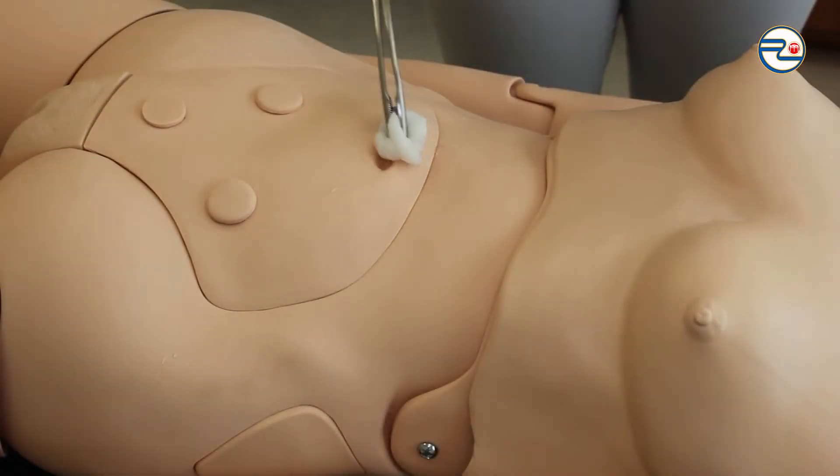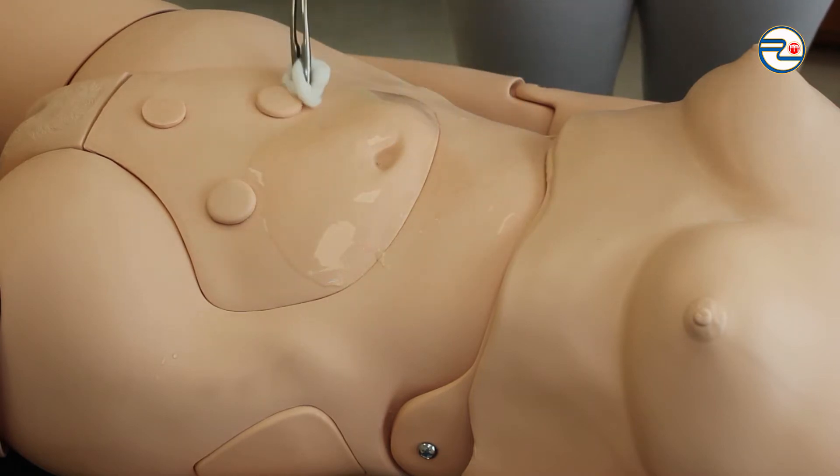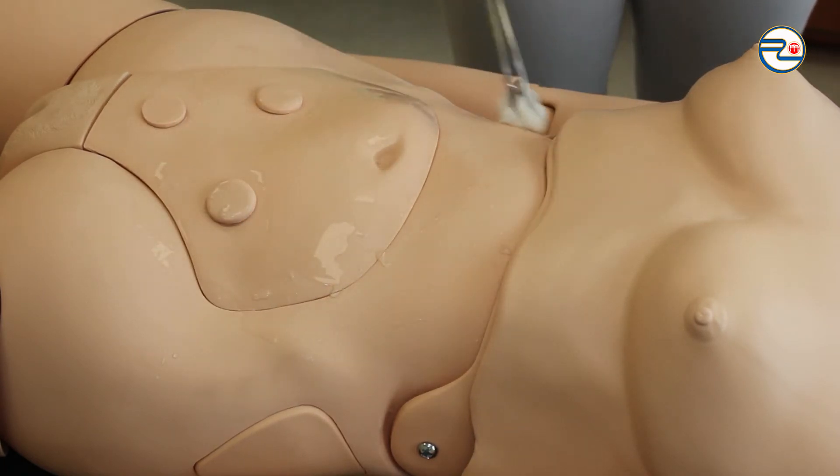I'm taking a gauze generously soaked in antiseptic with a sterile instrument, starting to prepare the surgical field from the center at the umbilicus to the periphery, preparing the surgical site in circular motions and not going back to already prepared places.